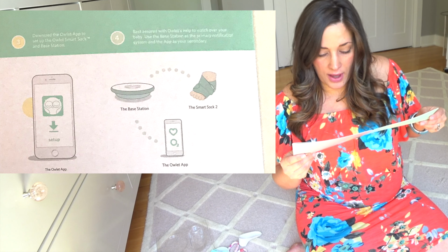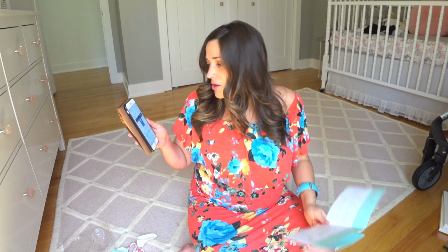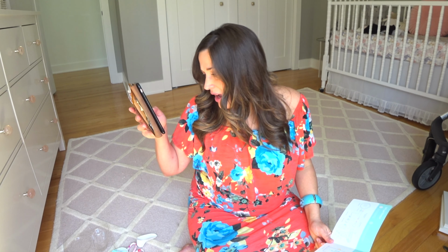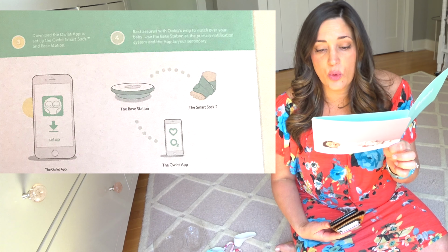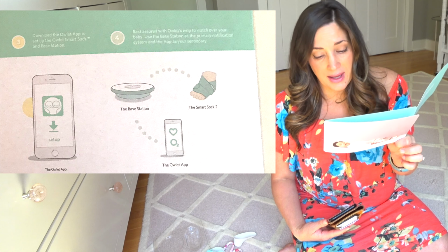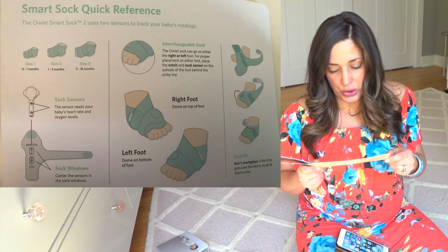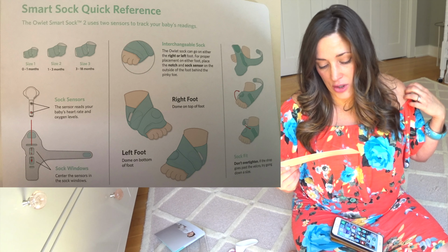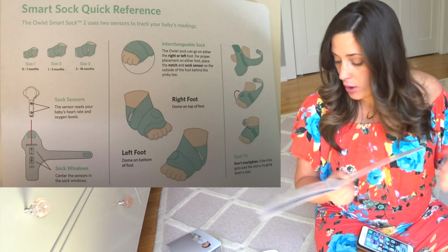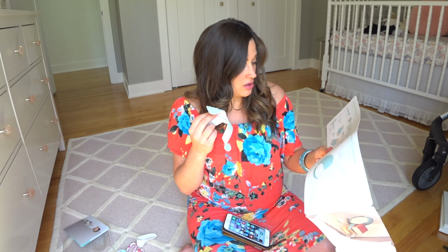Step 3, download the Owlet app to set up the Owlet Smart Sock and base station. It says download the Owlet app, and there's 2: Owlet Baby Care and Owlet Connected Care. Step 4, rest assured with Owlet's help to watch over your baby. Use the base station as the primary notification system and the app as your secondary. So we're gonna go to the quick reference guide now. It says that it uses 2 sensors to track your baby's readings. The sock sensor reads your baby's heart rate and oxygen levels. In the sock window, so once the sensor's in there, there's these sock windows, and you want to make sure the sensors are centered in those windows. The sock can go on either the left or the right foot.